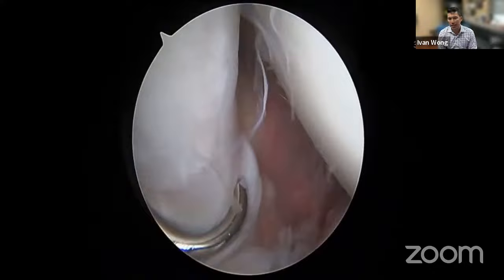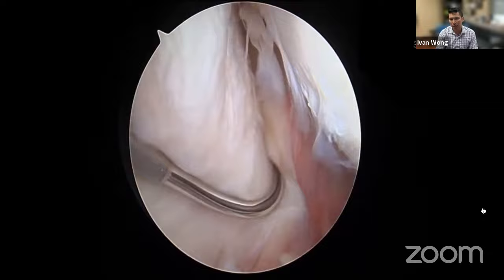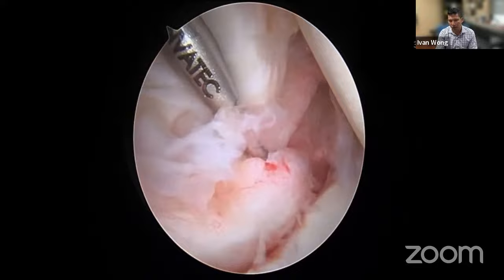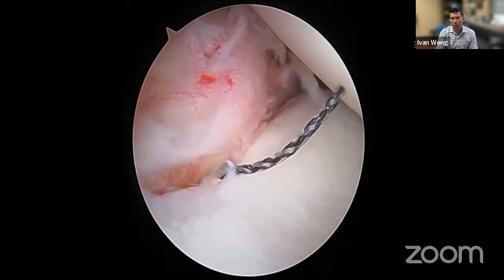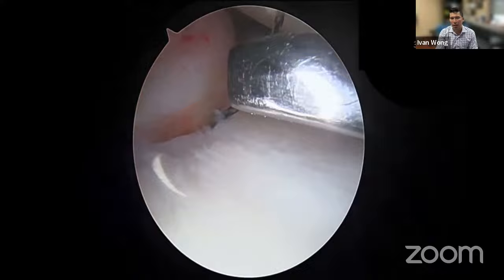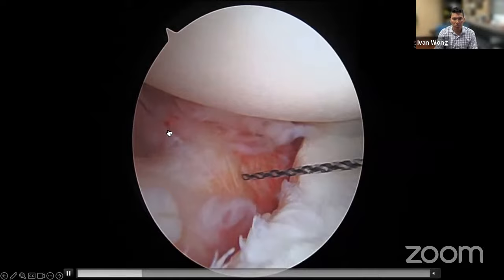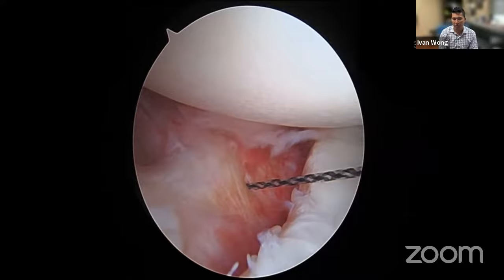The technique is exactly what we published in our technique guide. We grab the tissue at the three o'clock position — both the capsule and whatever remnant labrum exists. There's really no labrum here, but I want a full-thickness grab because this will be the traction stitch by which I'll lift the capsulolabral complex anteriorly and superiorly for a really good release. Take note of the quality of this tissue — it's not good, and I'd be worried it would pull through with a regular Bankart repair.